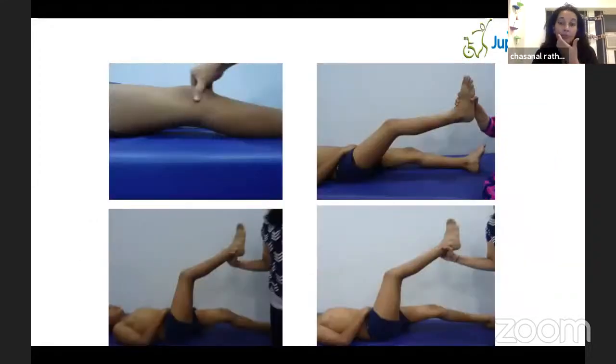So let's look at how the ankles are. We need to correlate it with the clinical data. How much is the knee flexion deformity? How much is the functional popliteal angle? The popliteal angle in 90 degrees of hip flexion. So all these are suggestive of a contracture or a short hamstring, of course.